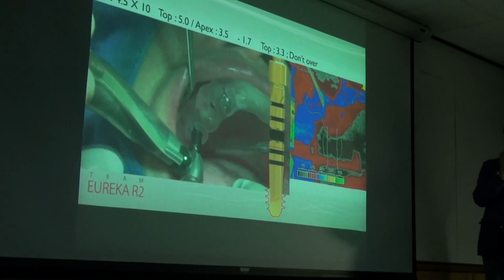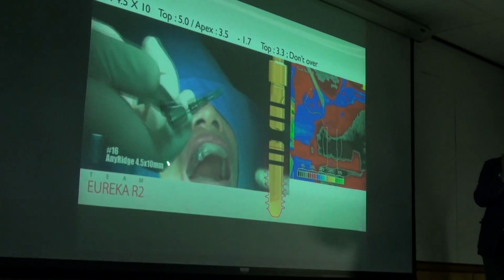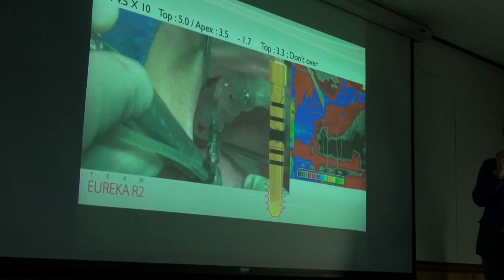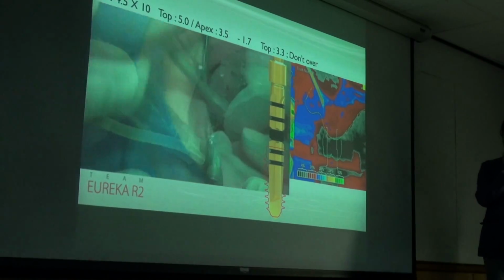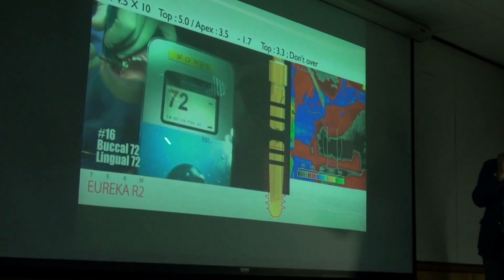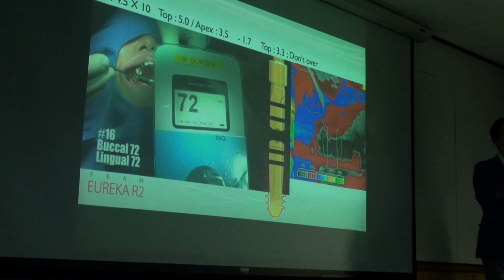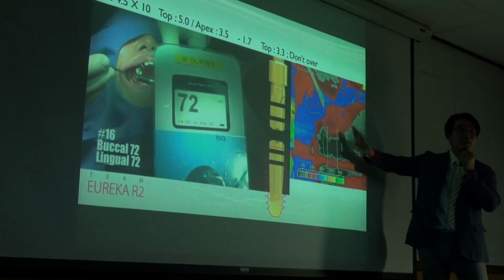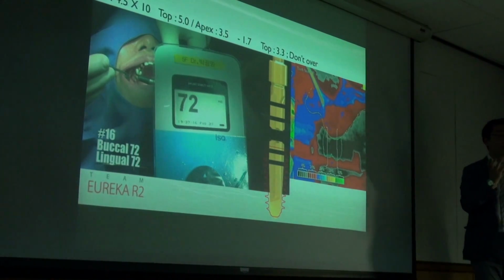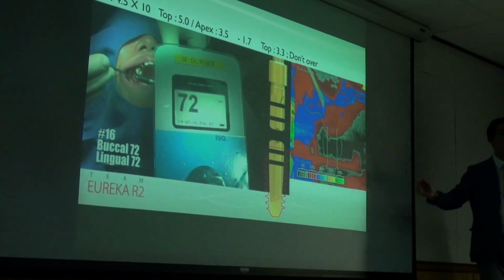After that, increasing the diameter, 2.8. And then pick up the 4.5 implant and put in an implant, because this is the soft tissue. So I obtained 35 Newton and the ISQ value is 72. Even though 35 Newton and ISQ 72 is good for immediate loading, mechanically this bone condition cannot bear a load. So in this case, we have to follow the conventional loading protocols.